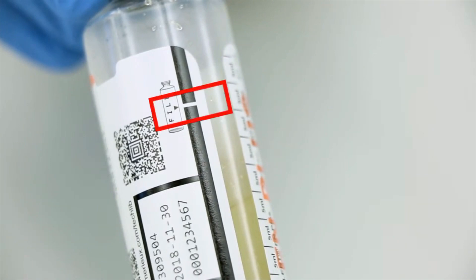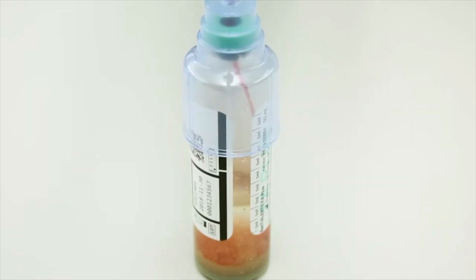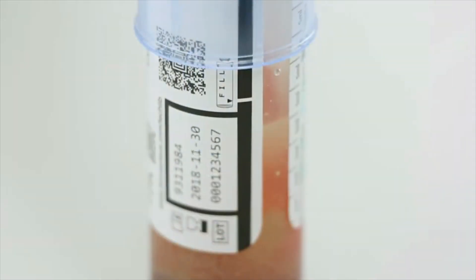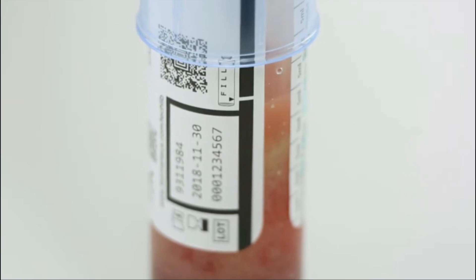The fill to mark zone designates the optimal volume of blood to be collected: 10 milliliters. This feature provides two benefits. One, a visual target to aid the collector in drawing the optimal 10 milliliter volume of specimen in accordance with the product package insert, which increases blood collection performance and eliminates the need to manually mark the bottle.